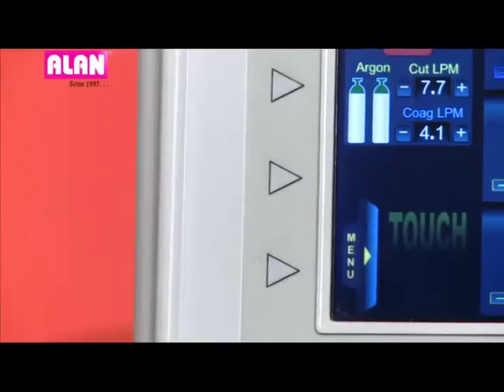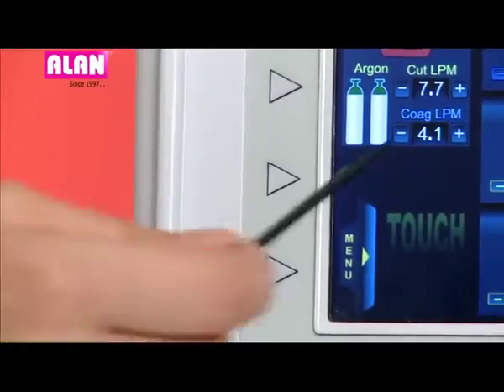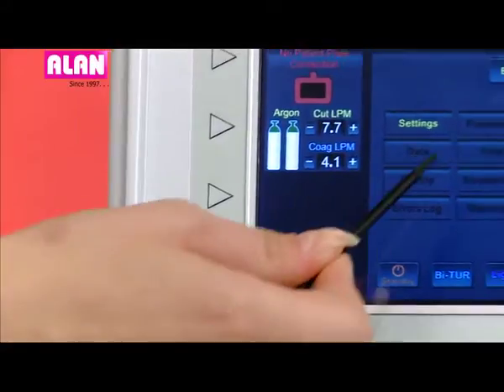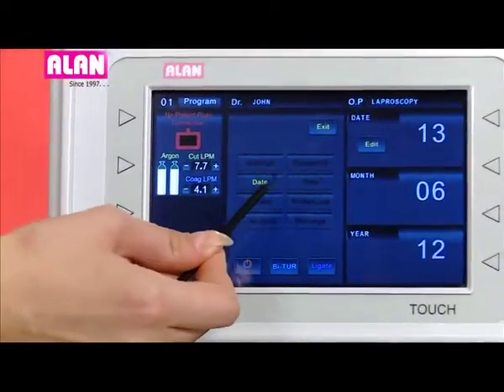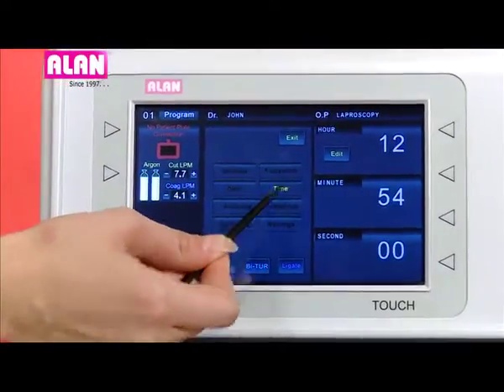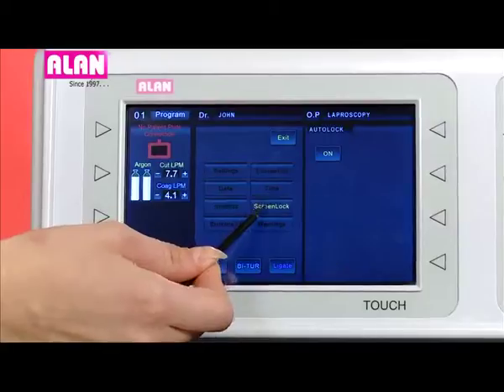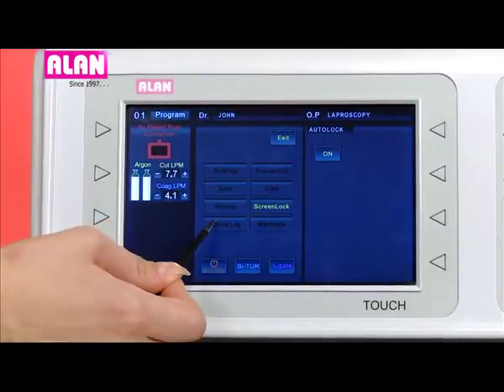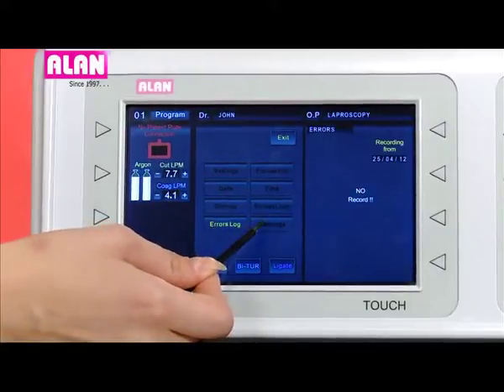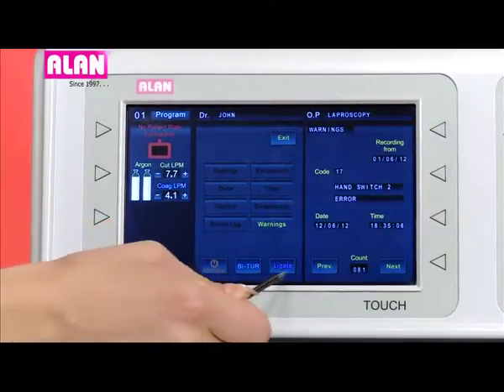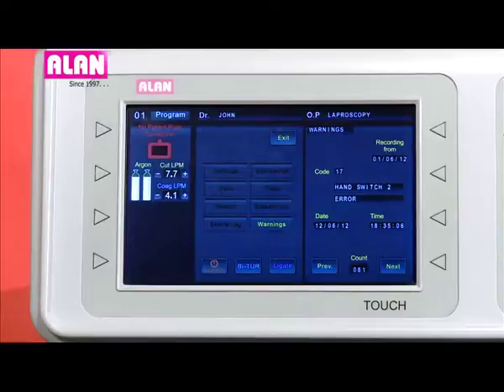The menu icon is located on the left side. It has setting, foot switch, date, time, startup, screen lock, error log, warnings, standby, BiTUR, and LiTUR icons.